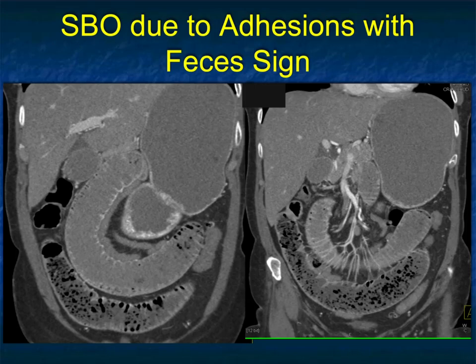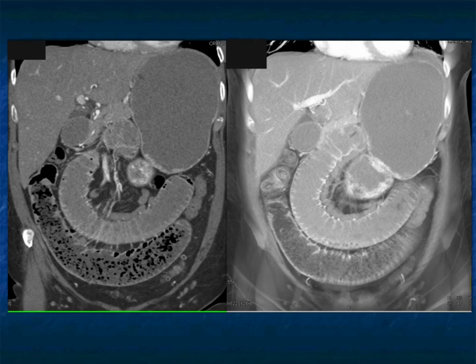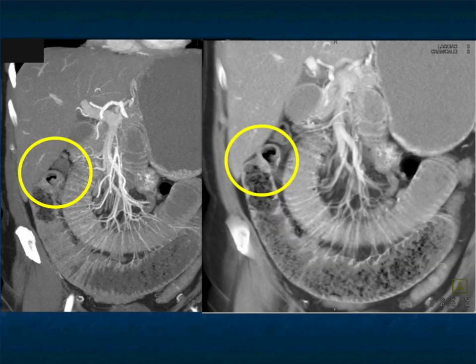Here's a nice example of dilated bowel shown very nicely on the coronal view. You can see the fluid of the small bowel, and then this loop with mixed density — that's the feces sign. You track it to right here — that's the transition point. There's no mass and no hernia there; this was an adhesion from prior appendicitis. This patient went to surgery. So you have all the key findings: dilated bowel, mesenteric vessels patent, transition point, and the cause of the transition.